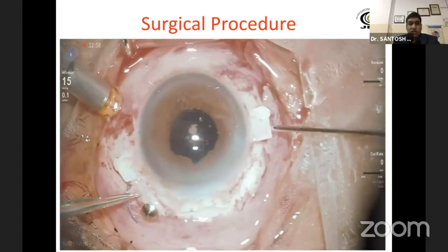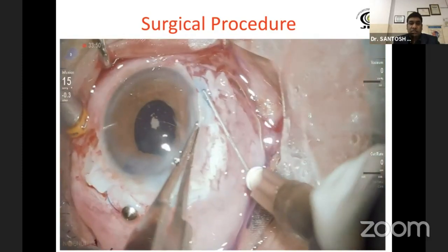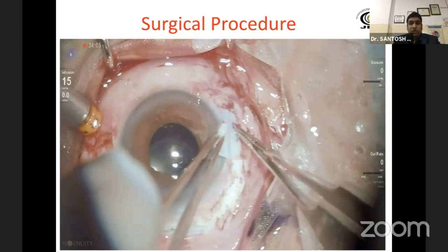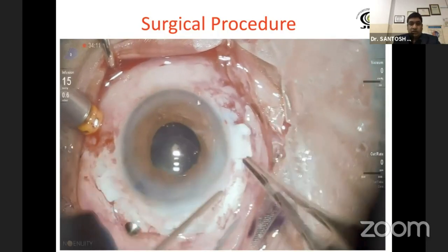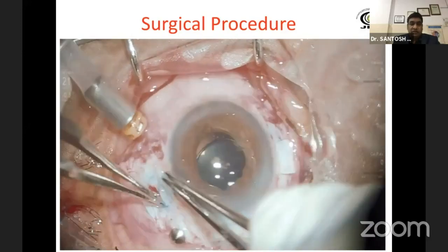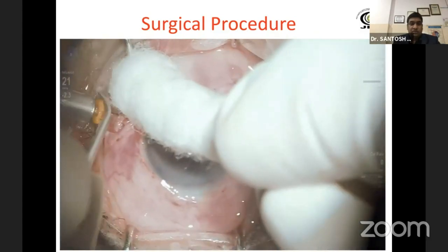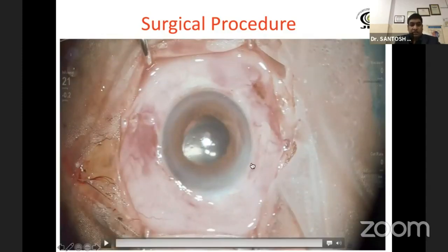The haptic is out and in proper position now. The side tunnel is being made, and you can change your hand to facilitate this tunnel creation. At the end, we are not putting any sutures on the sclera — just the conjunctiva is sutured and it is looking fine at the end of the surgery.